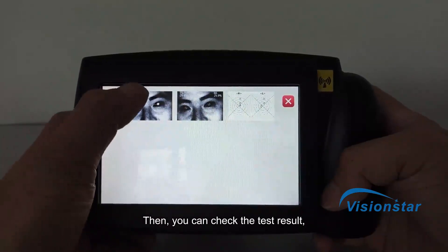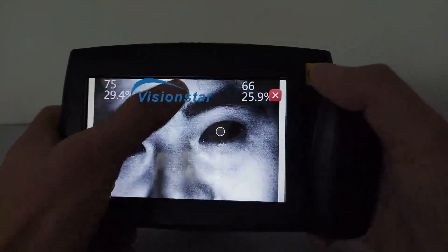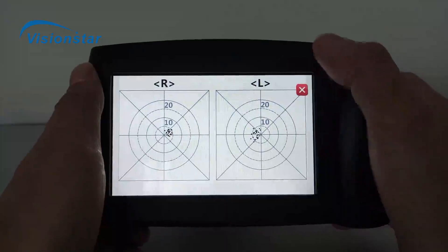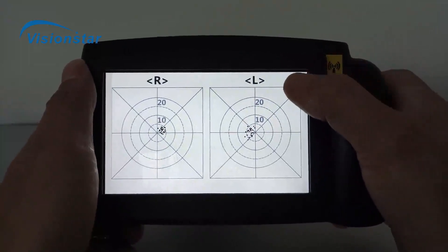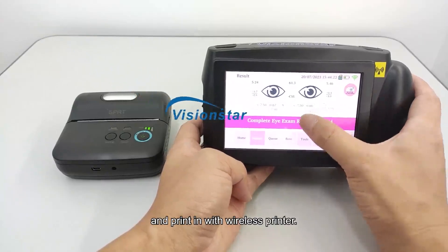Then you can check the test result and print it with a wireless printer.